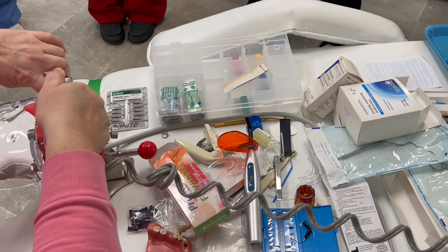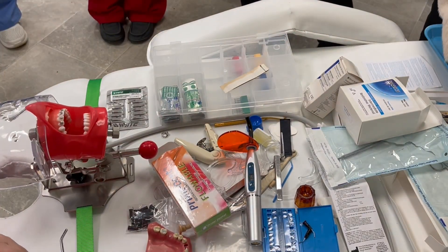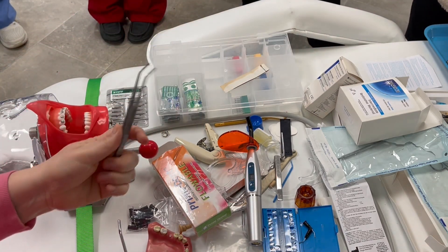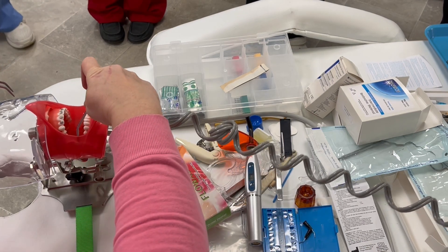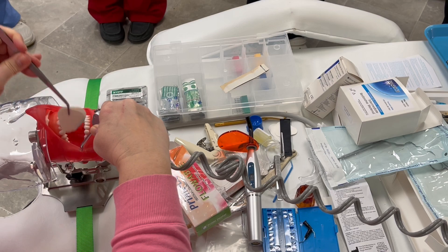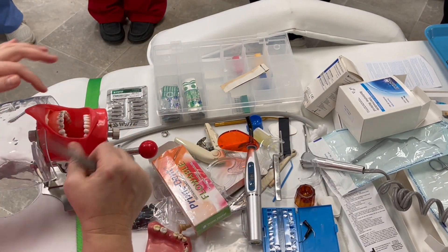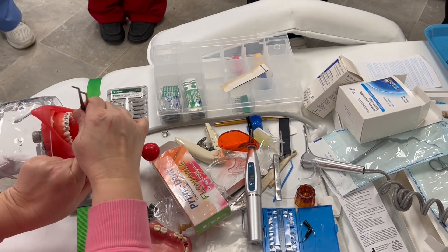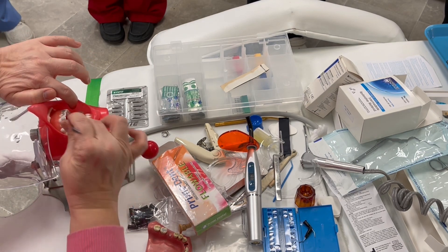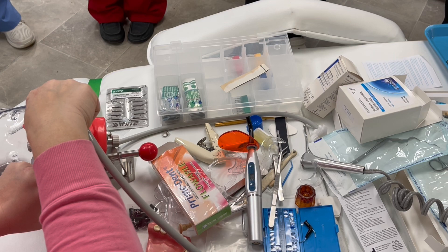Do you see any pickups? Hand me that pickup — cotton plier or pickup, just different names for it. I'm going to saturate it until you see it just fall by itself. You don't want to pull — you don't want to catch that mucosa. And you just take it out. Then look around the mouth, check the vestibule — that nice area where you always get salad and stuff stuck — swipe it out. Check the lingual. There's no cotton there, none in the vestibule — we're good.